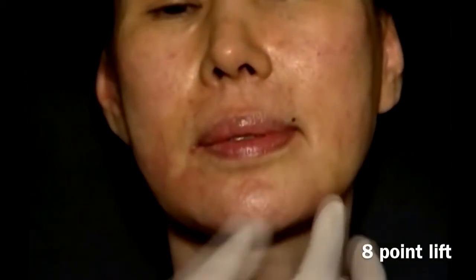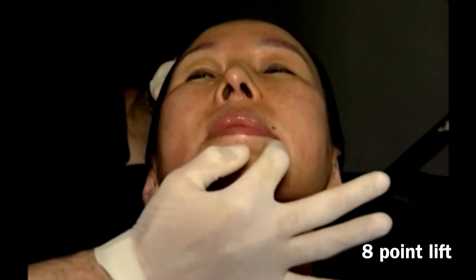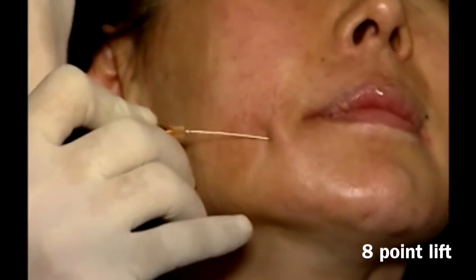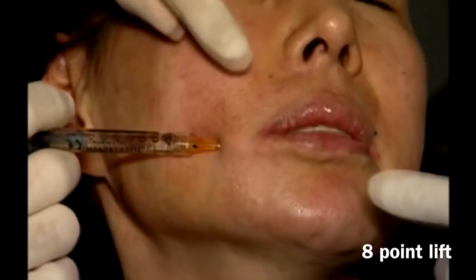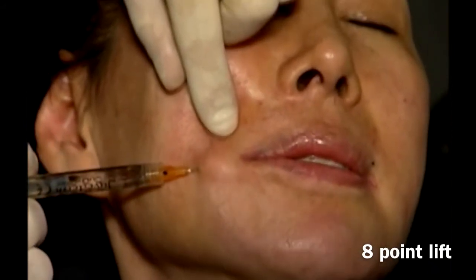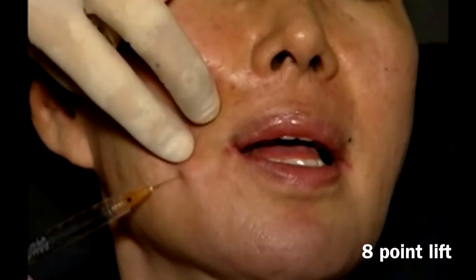We see that the oral commissure has lifted on the right, and is also more projected when compared to the left one. Another entry point, and the change to Juvederm Ultra Plus. Getting the product through a cannula in the body of the lower lip, we proceed with the filling and replacing volume. Retrograde, check and reinforce the mucosa at the oral commissure. A more lifted correction at the oral commissure and marionette line complex is obtained.